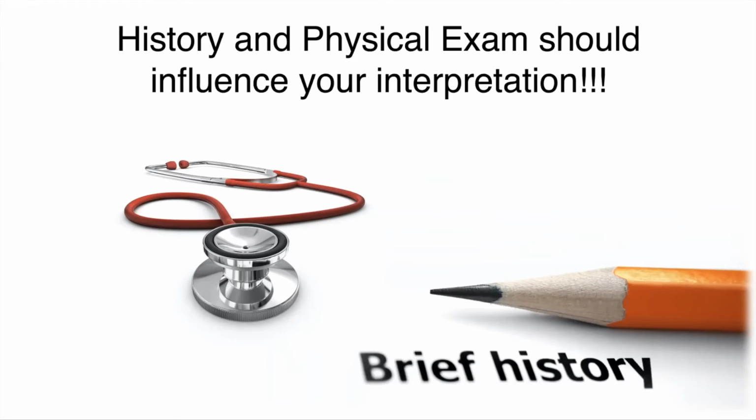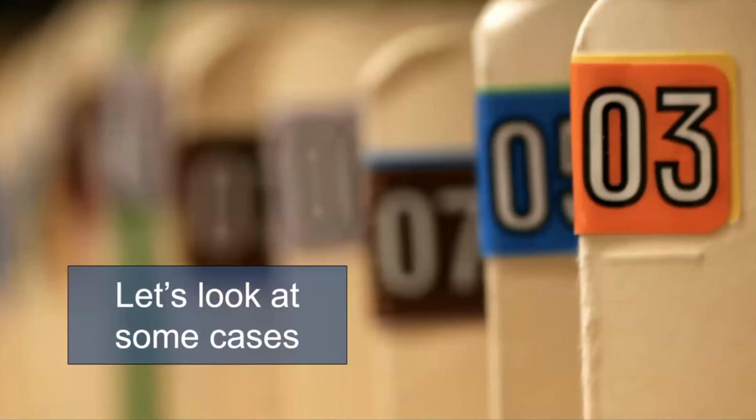That also makes it really hard for radiologists who are reading in a vacuum, who don't have a physical exam to guide them. And so, as many of you have heard me say, we really should be looking at our own films because we have the best idea of what's going on with the patient. And for many of you who are leaving and going into the community setting, you will be reading your own films, sometimes even during the day. So you've got to get comfortable doing it. So let's look at some cases.